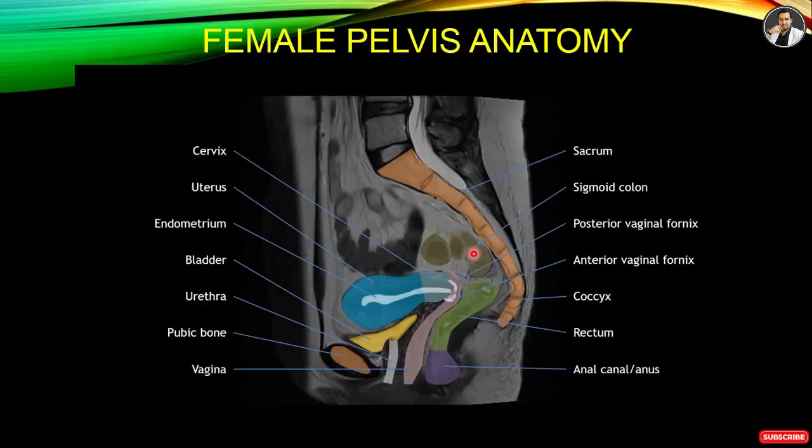The doctor has written a list of the patients. But we have to see the history of the patient. There are many problems in the patient: bladder, prostate, rectum, testes. We have to focus on the patient. If there is no specific problem, we can show the entire pelvis.